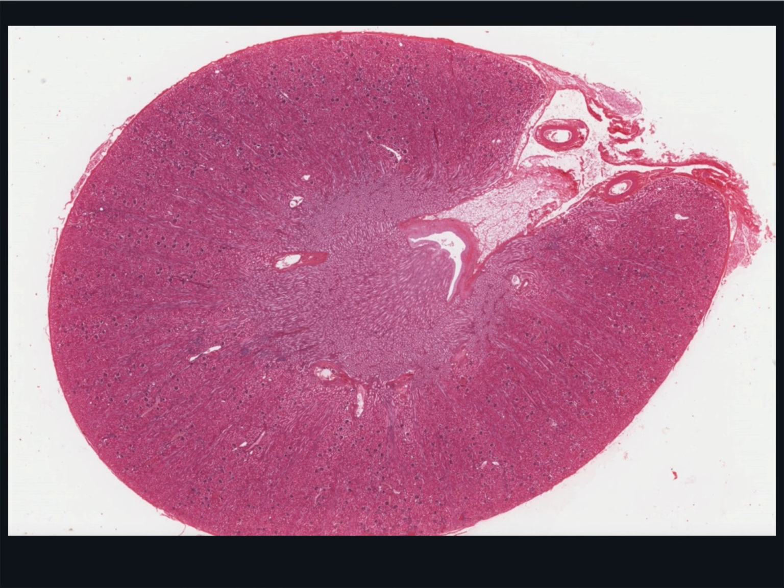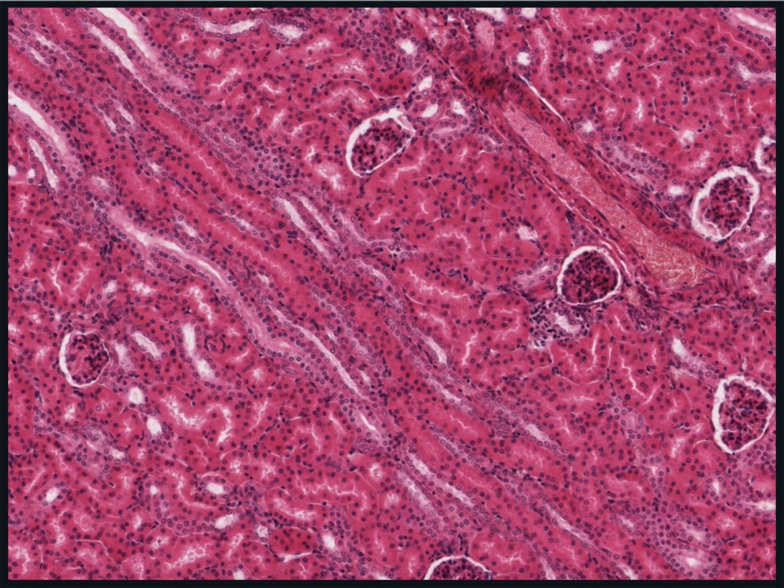Now this is an appropriate time for you to consider the lobular structure of the kidney. A lobule is the cone-shaped unit of tissue which is involved in secreting urine from one papillary collecting duct. A medullary ray lies in its centre, and the labyrinth area containing the rest of those nephrons form the outer part.